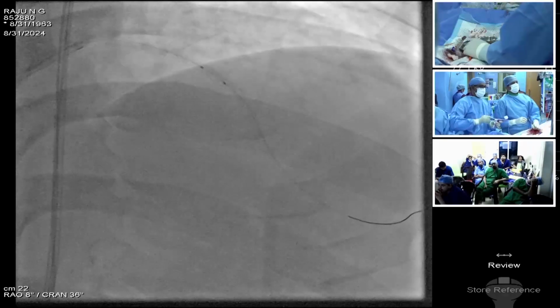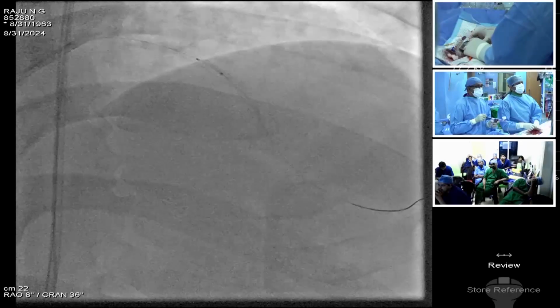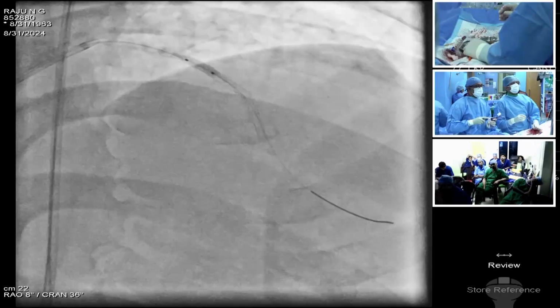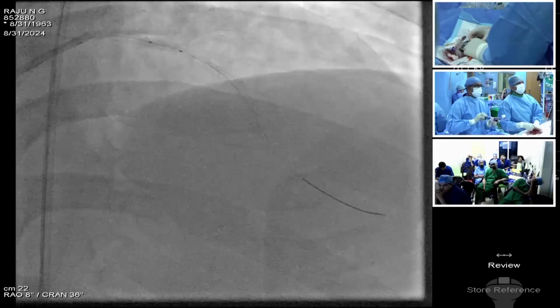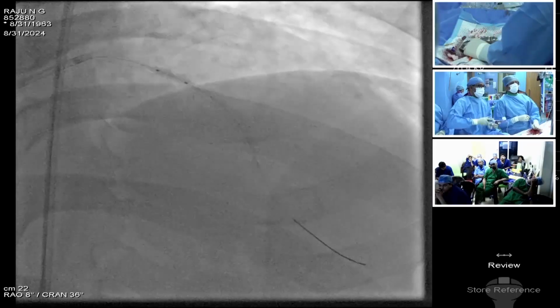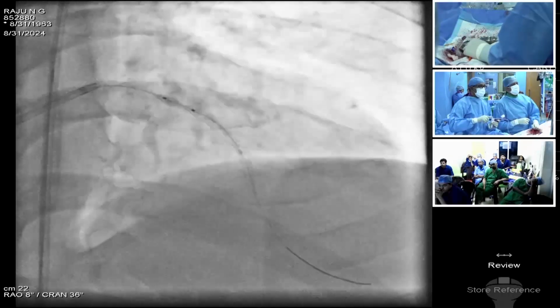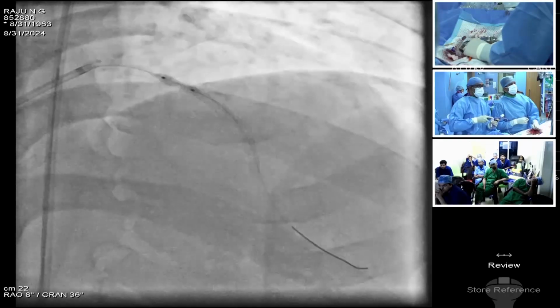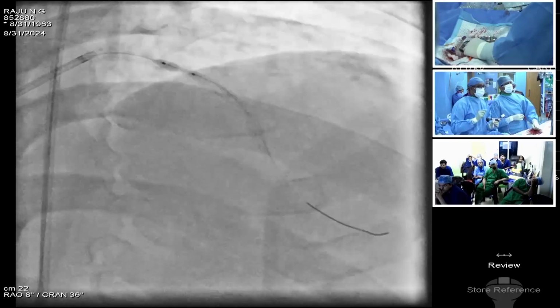Okay. 14, 16. Okay. Wire tip. 14, 16, 18. It's open there. Okay. 14, 16, 18, 20, 22, 22, 24.